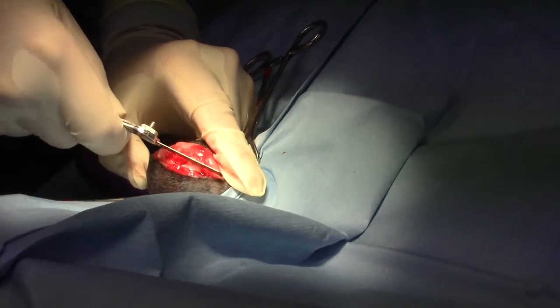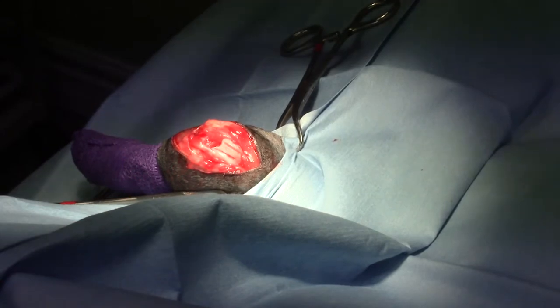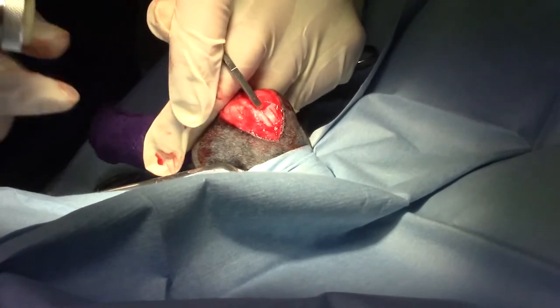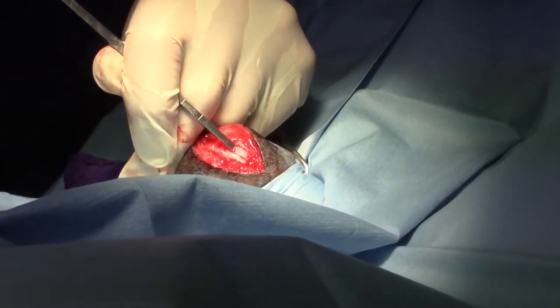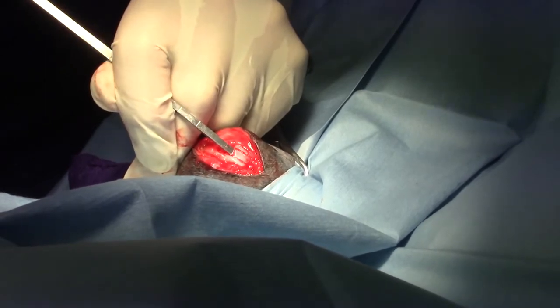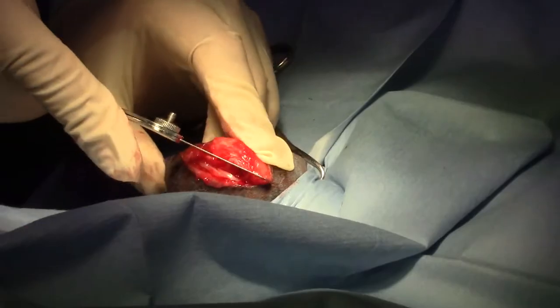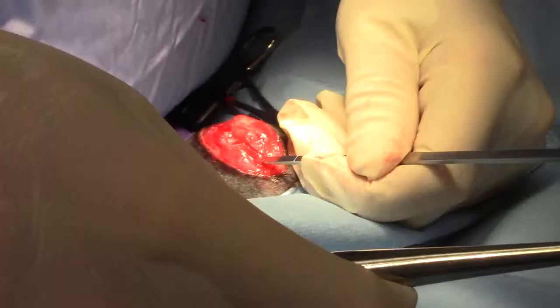The next step is to deepen the trochlear groove by doing a trochlear block recession. We make cuts on either side of the femoral condyles, and then chisel out a rectangular piece of bone that's covered with articular cartilage. The purpose of this is to deepen the trochlear groove while preserving the articular cartilage. We remove this trochlear block, set it aside, deepen the groove, and then replace it. Now I'm going to use my bone saw to deepen the groove on either side, and then chisel out the bottom with an osteotome to make the groove deeper, and then put the trochlear block back.